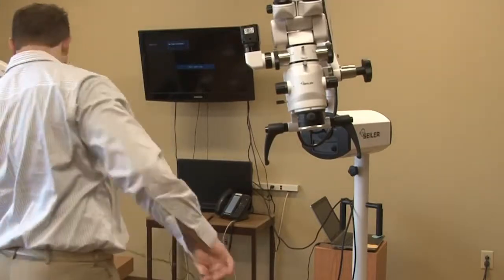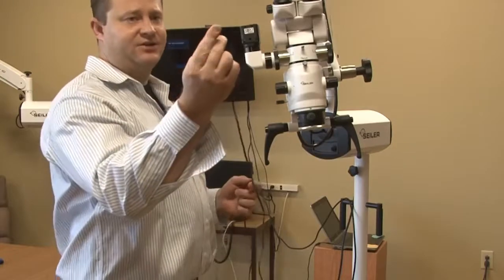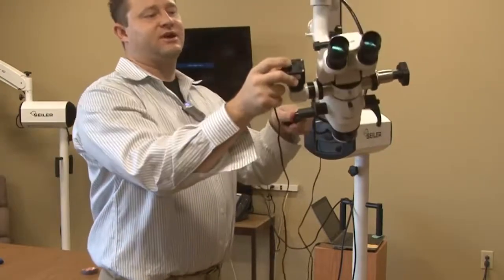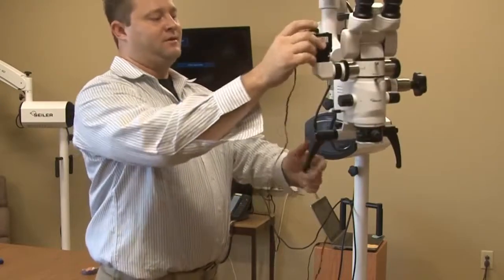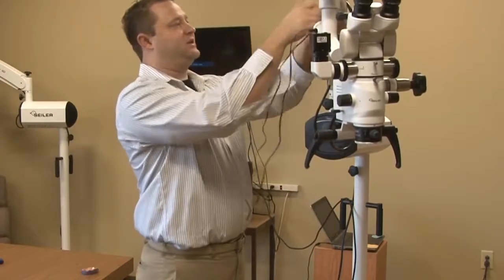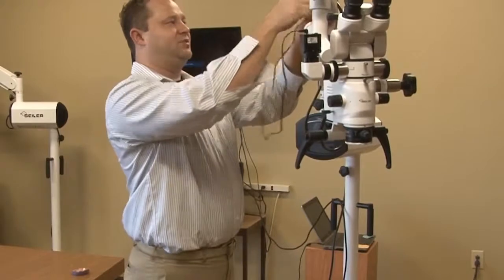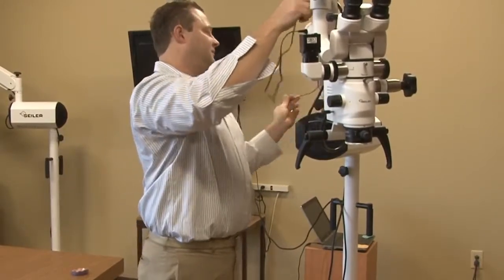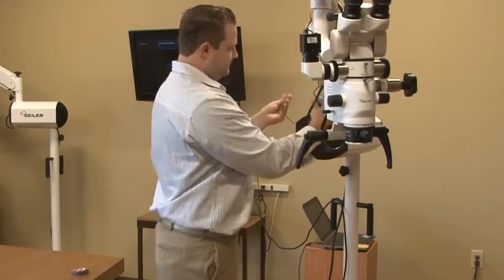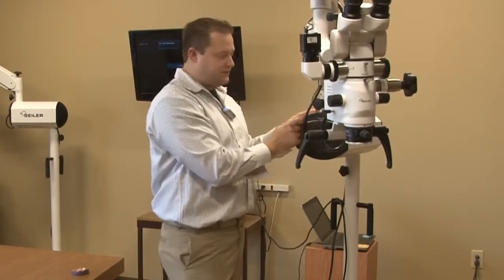Now we've got our power camera power cable. We want to make sure the 90-degree cable is going to be inserted into the top portion of the camera. What we would typically do is thread the power cable all the way down — this is more for cable management purposes. And this is going to plug directly into the illuminator.